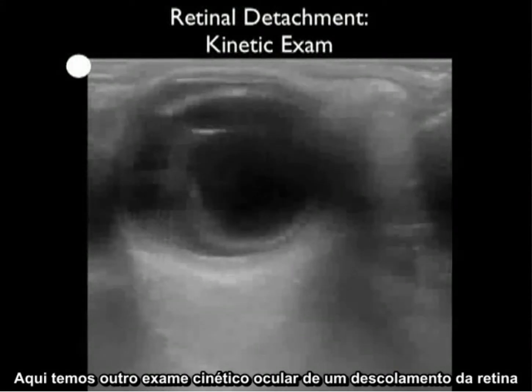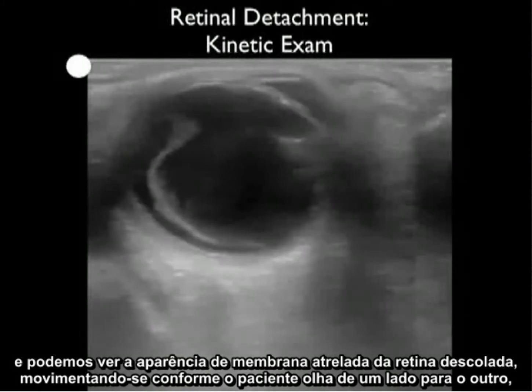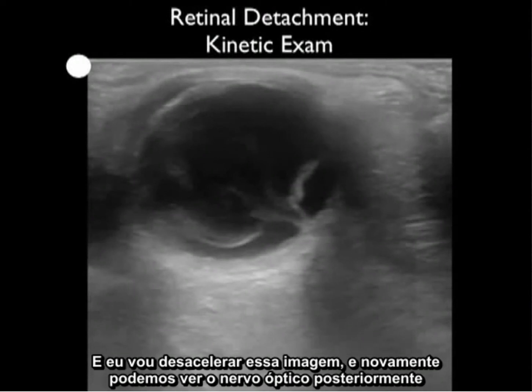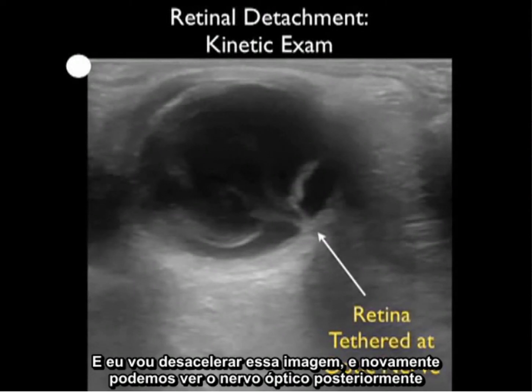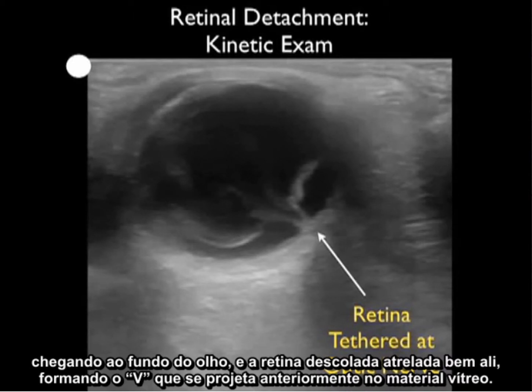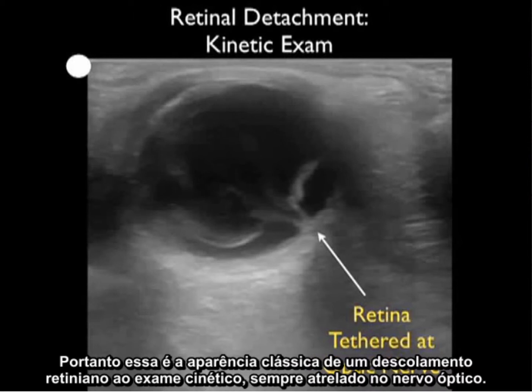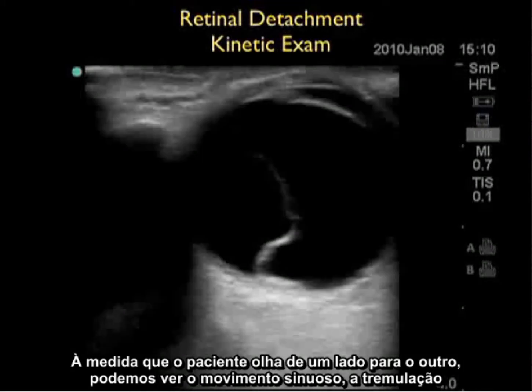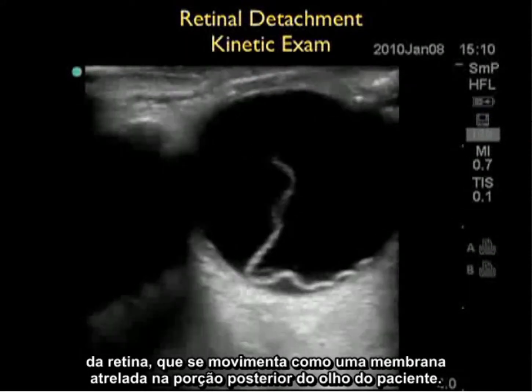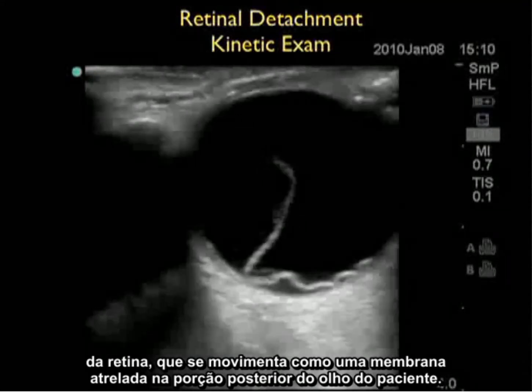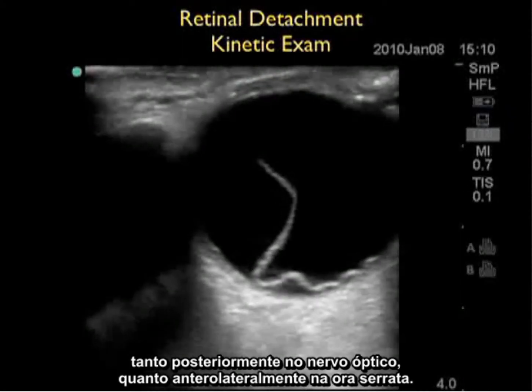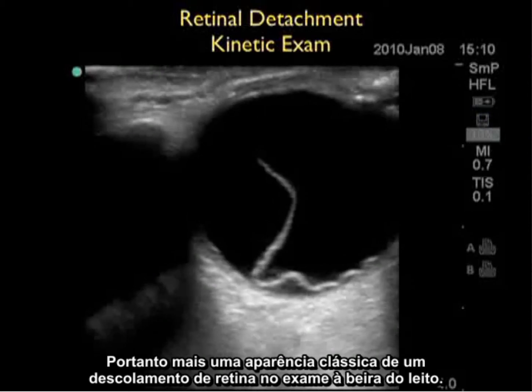Here's another ocular kinetic exam of a retinal detachment. We can see the tethered membrane appearance of the detached retina moving as the patient looks from side to side, with a classic V-shape that tethers in at the optic nerve sheath. Stilling the image, we can see the optic nerve posteriorly and the detached retina tethered there, forming a V coming anteriorly into the vitreous material. In another clip, we see the serpentine motion — the flicker of the retina — as a tethered membrane attached both posteriorly at the optic nerve and anterolaterally at the ora serrata.